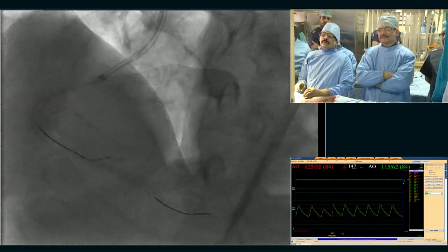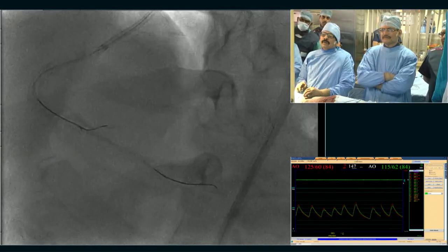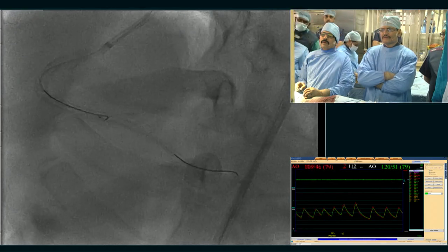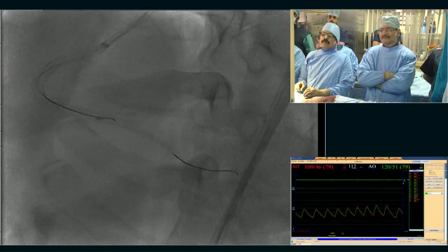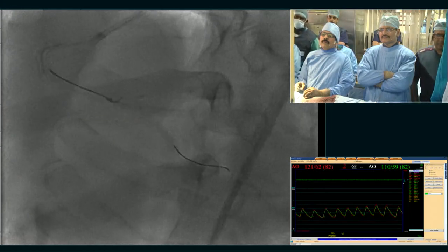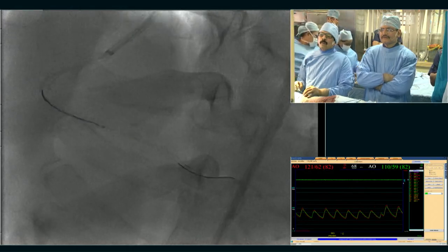And remember, my teacher always told me that you have to have plan A, plan B, prepare the case well. And this is where maybe we have not seen the distal properly before we started putting another stent, where we made our life now more complicated. But this is a good learning case because we learn from these cases. Yes. And this is why we are presenting these.